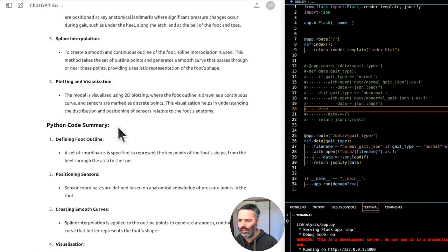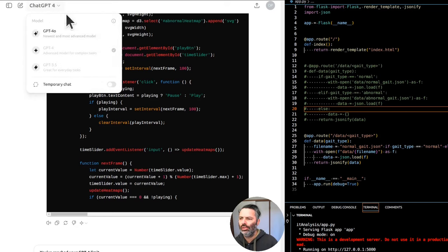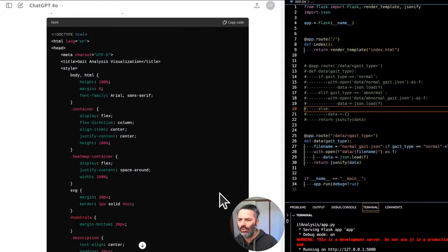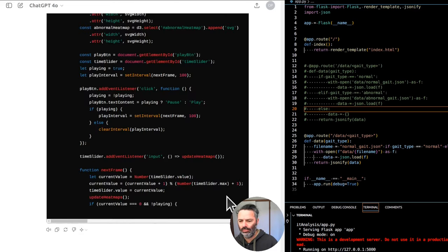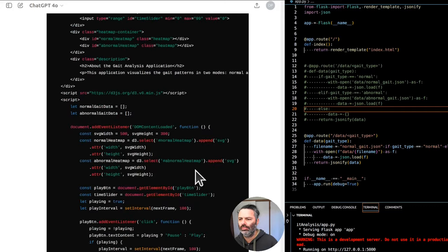It's generated. Summary of the application and Python code for 2D foot model with sensor positions. Application overview. The primary goal of the application is to create a 2D model of a human foot, including pressure sensors placed at anatomically relevant locations. This model is intended for gait analysis, helping to visualize and analyze pressure distribution across different parts of the foot during various phases of walking or running.